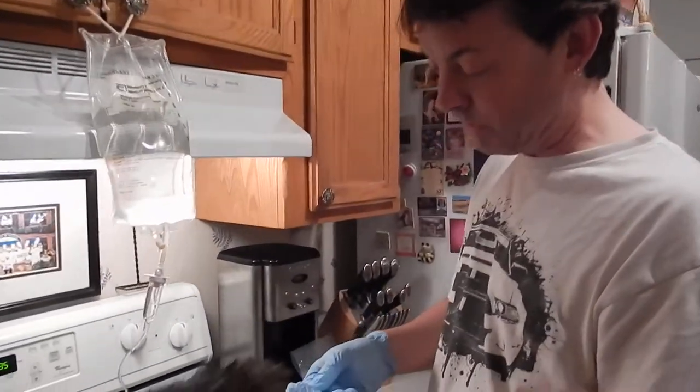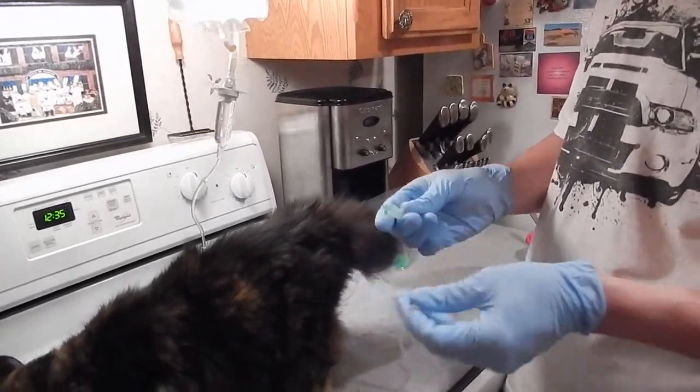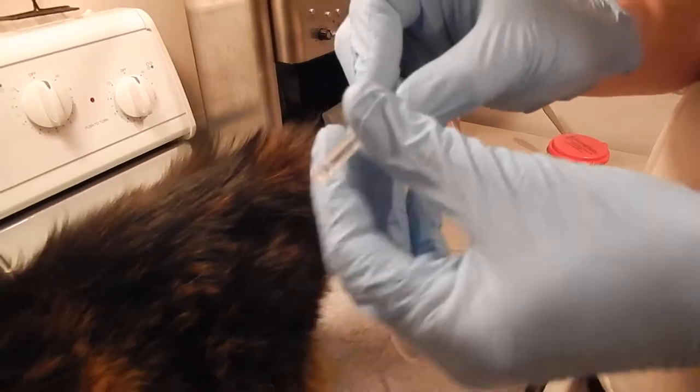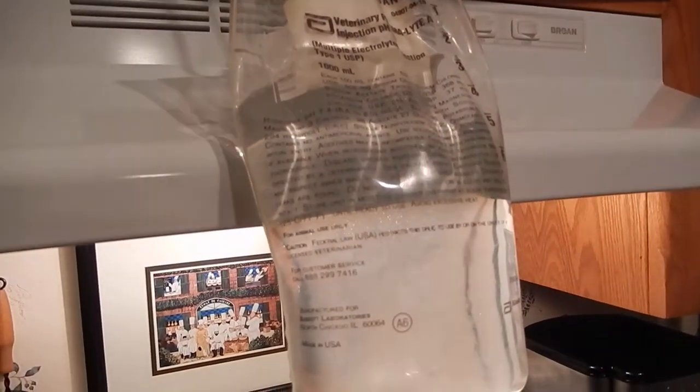I'm going to show you the needle first of all. There it is. I don't know if you can see that against my glove, but that's the needle — that's what's going to go in Fufu. And then here is the plasma, the fluid medication.